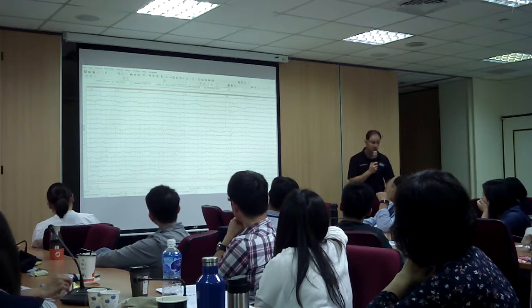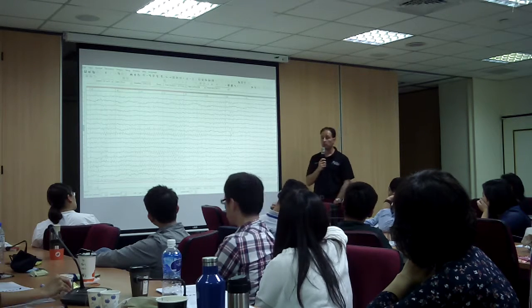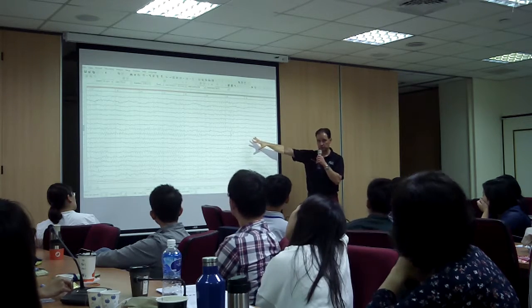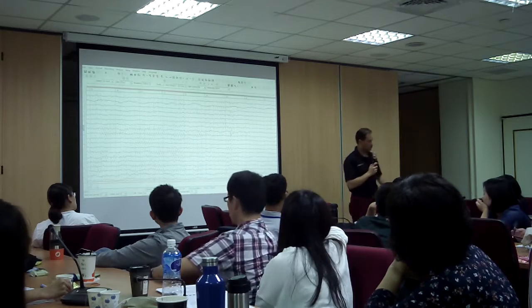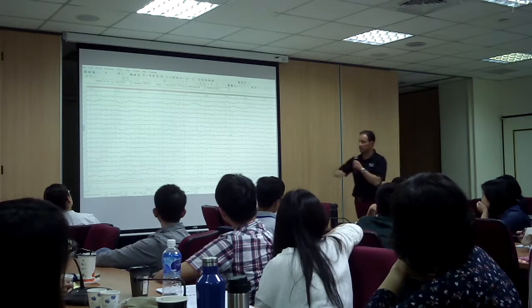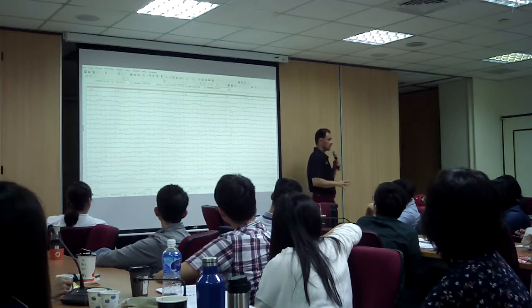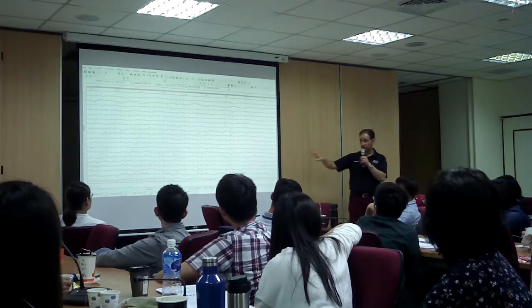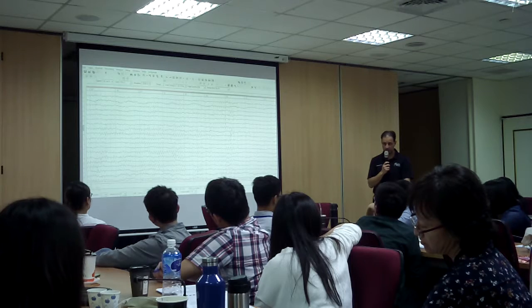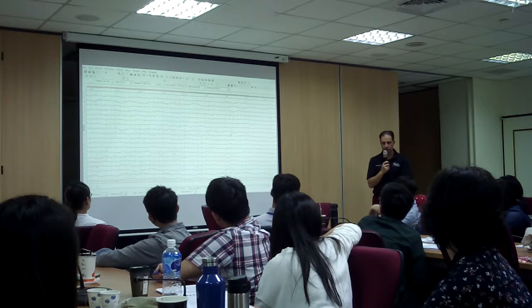Now, let's assume there's a lesion, a gray matter lesion, okay? What could have caused it? What would be the reason for there to be a gray matter lesion? What do you think is causing it? And there's a lot of slowing. So this plus the slowing hold the key. What was the cause of that slowing and the gray matter issues? What could cause a brain lesion? A brain injury, what could cause it?